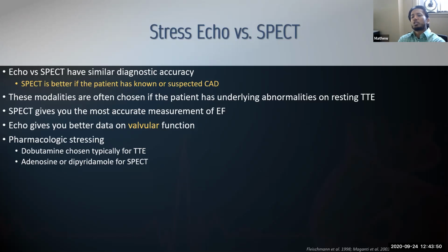So that's a good question. If you have diastolic dysfunction, this is going back to not just stress testing, but any echo. If you suspect it even on something like a diastolic murmur, that's when your indications apply, regardless of the grading severity, because we know that grade 3 out of 6, okay, that's when they should get an echo. 2 out of 6, not as much of a concern. But if you have any diastolic murmur, that's when we get concerned. If you see diastolic dysfunction with exercise, that's when we get concerned, not as much with rest. That's when it occurs with exercise and it wasn't present on the resting echo.